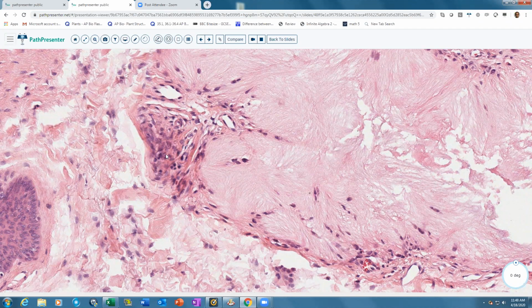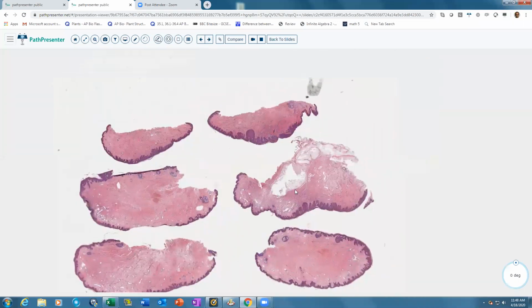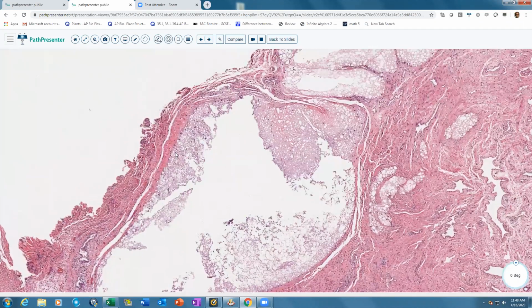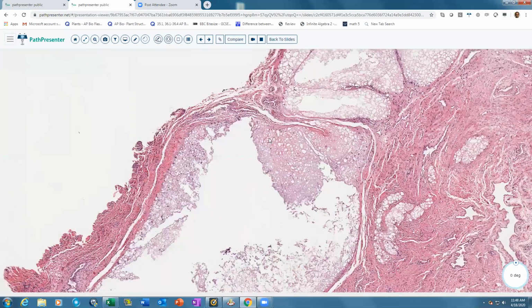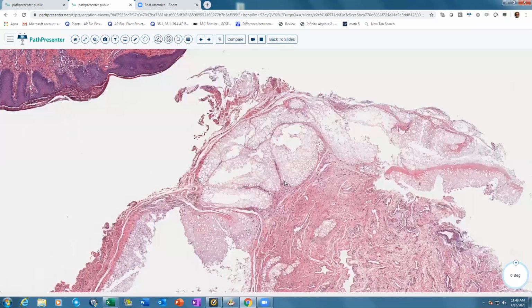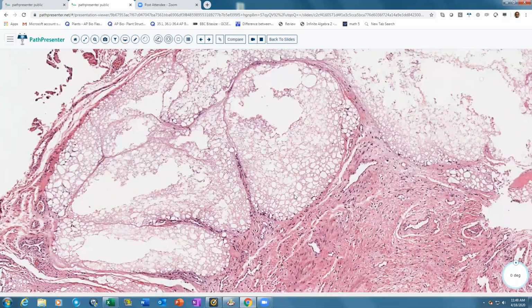And if you just see the pale material and you don't see the foreign body reaction, like in this biopsy here, you can still see some material here, but outside of the material we don't see the foreign body reaction. This is very characteristic of triamcinolone, so a patient that has been injected with Kenalog. This is all triamcinolone injection, which you can see is again pale pink material within the dermis forming these big nodules, but normally they don't tend to have a foreign body reaction. So if you see the foreign body reaction, more likely to be gout. If not, then more likely to be triamcinolone.